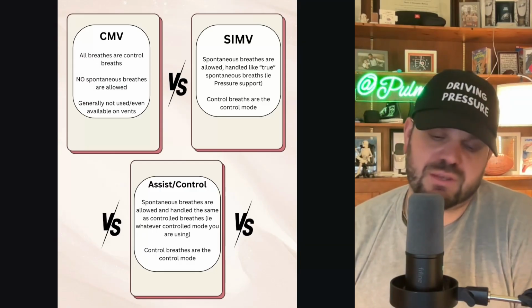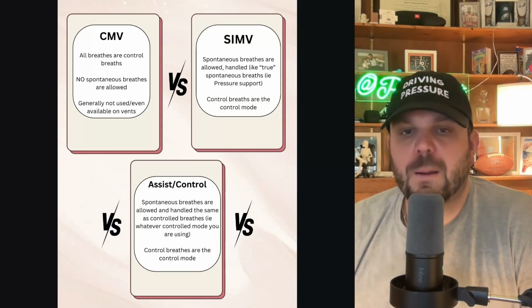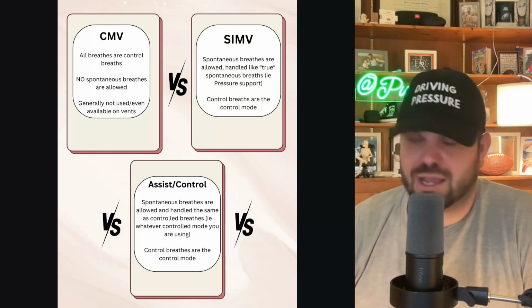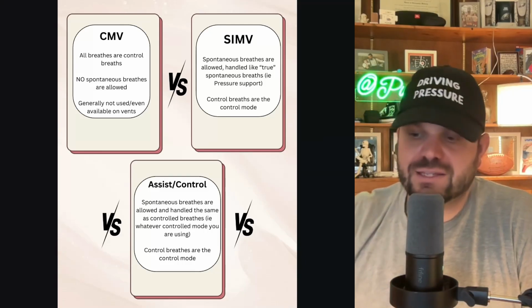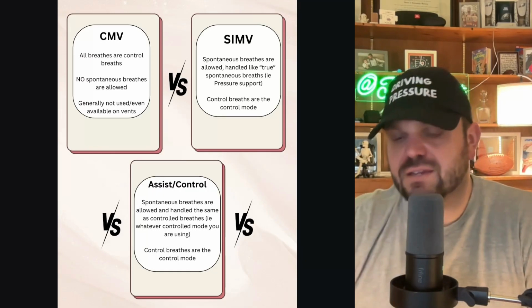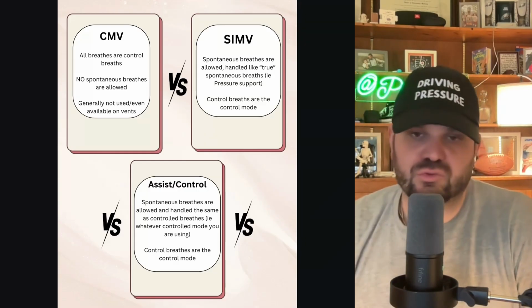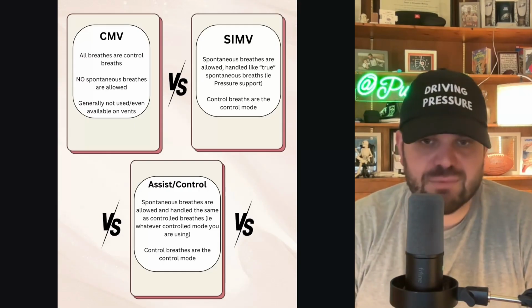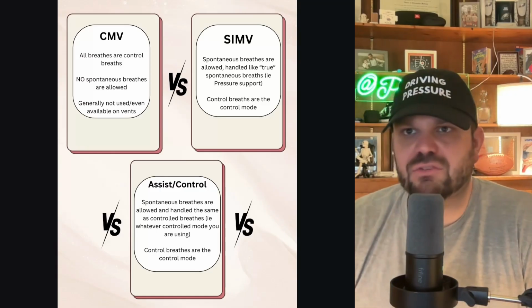And that was found to be sort of hogwash and it doesn't work. And all SIMV does is essentially make the synchrony worse. But saying that SIMV doesn't support spontaneous breaths is just not true. Because if you had SIMV volume control, and on the controlled breaths you needed 25 centimeters of water above PEEP to drive in that volume, and on the pressure supported breaths you only gave the patient 10 centimeters of water above PEEP, then yeah, you're cutting the support in half. But that's not a result of the mode, that's a result of the operator.